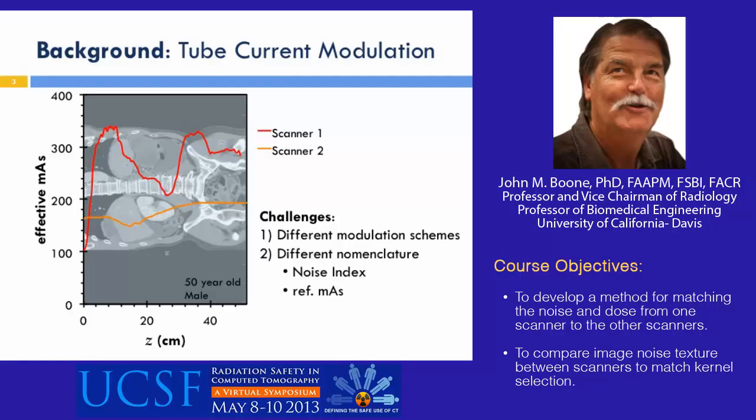You also have a widely varying nomenclature between the various CT manufacturers. Their tube current modulation nomenclature in particular is quite different, and also is different in terms of how it behaves numerically. So we'll explore that in this short lecture.